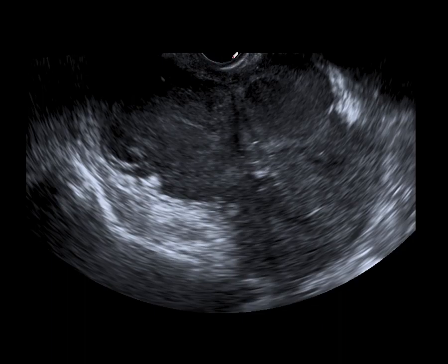We can see from the characteristic appearance of the probe face, and this is therefore probably about 10 or 11 centimeters solid mass. We're immediately thinking this is likely to be a malignant tumour, and you can see here it's got a lobulated border to it. So this here is very suspicious for a malignant tumour.